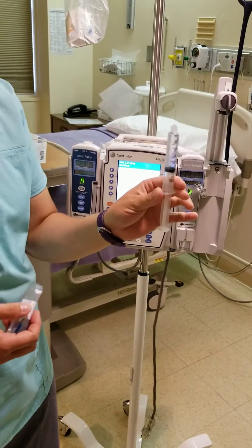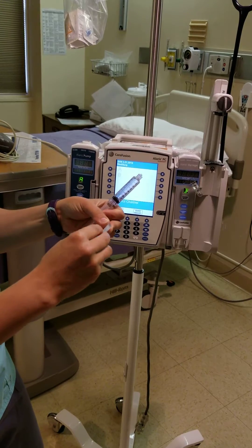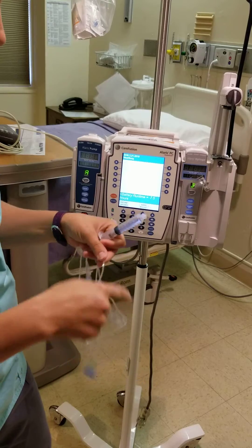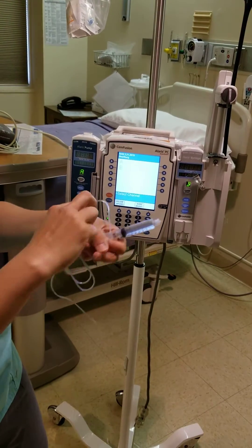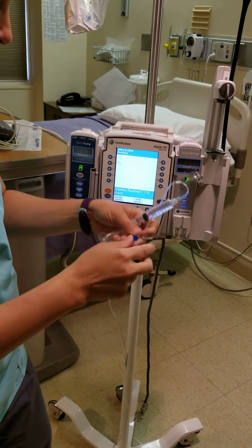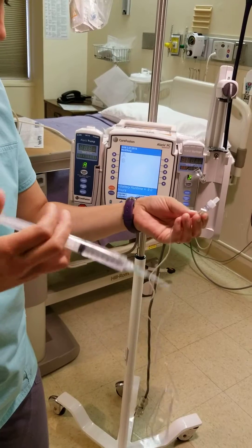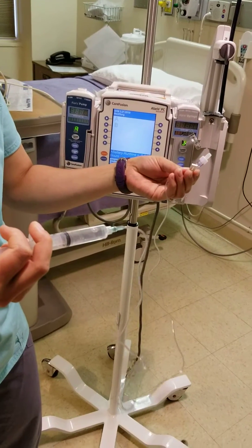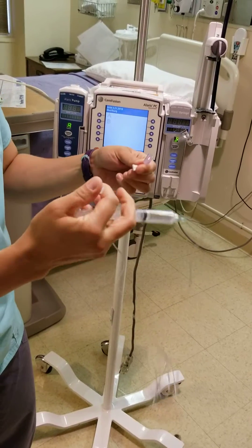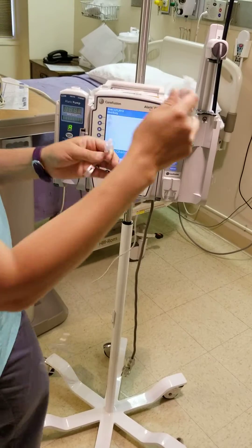You'll get your syringe from pharmacy with hopefully a patient label. We do not have the function to prime our tubing using the pump, so this you'll have to prime on your own. Push the fluid through. And there you go — it's already getting a drip out.